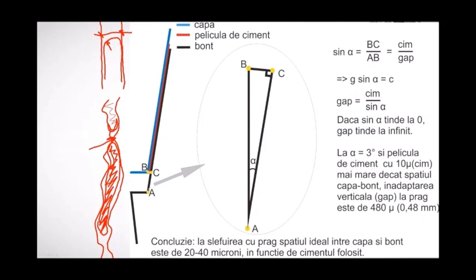And in between B and A, when B falls down on the shoulder, you need to have a space for the cement. Maybe smaller, just between A and B. But otherwise it should touch freely on the shoulder.